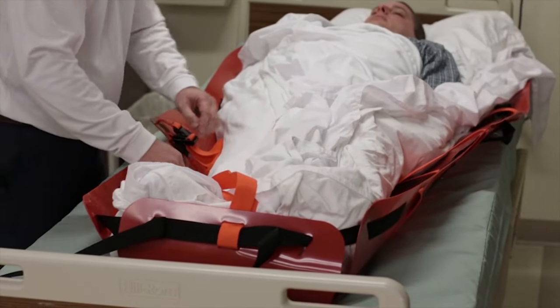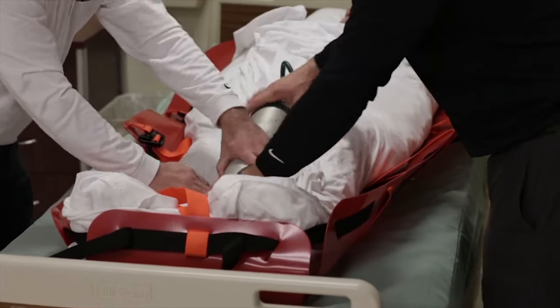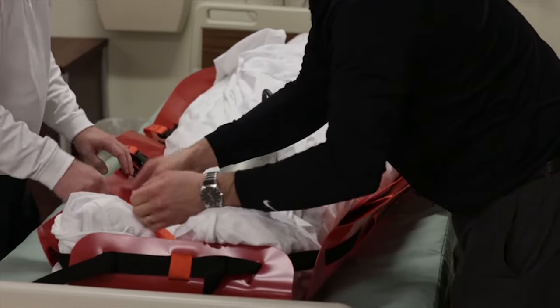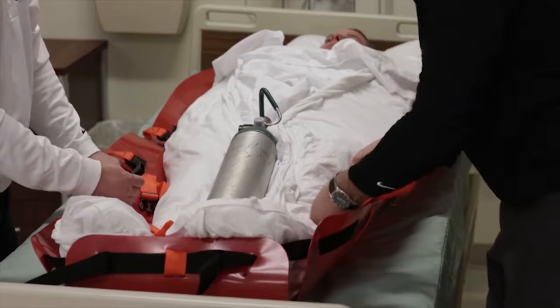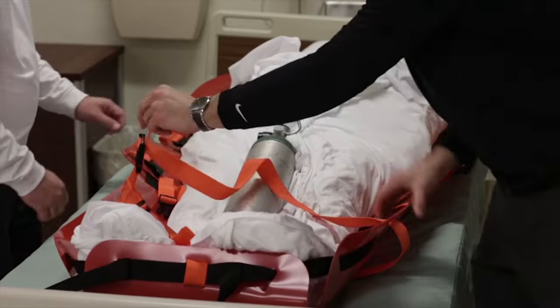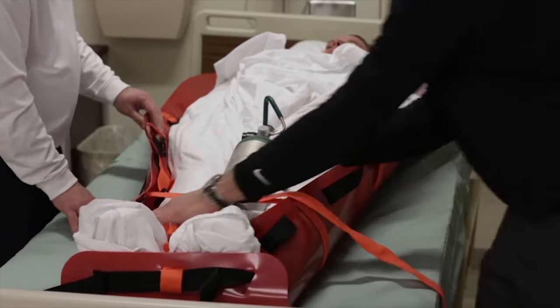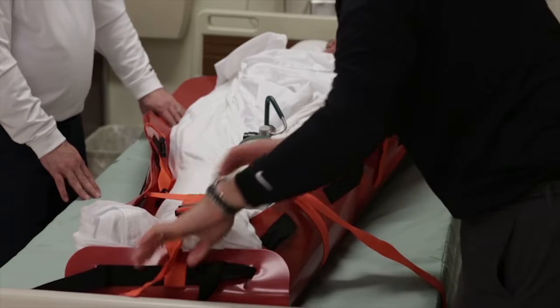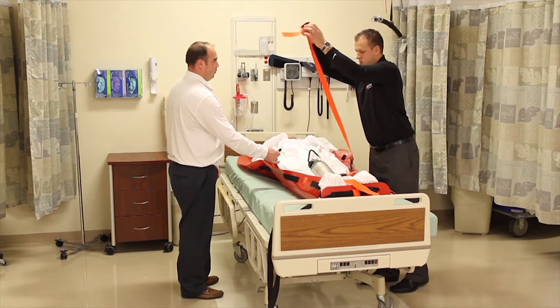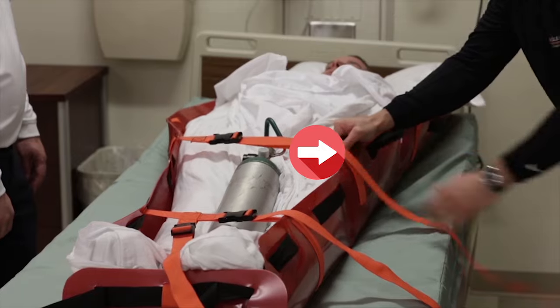Next, align the foot loop strap between the patient's feet. Add any equipment or supplies that need to be moved with the patient. For example, an oxygen tank would be situated between the patient's legs with the valve facing up. An IV bag would be placed between the arm and body of the patient or above their shoulders. You are now ready to secure the patient into the sled. Starting at the foot end, attach the buckles, pulling the straps under the person, then fasten the buckles. To prevent the cross straps from slipping, place your thumb on the cross strap against the sled while tightening to comfort.